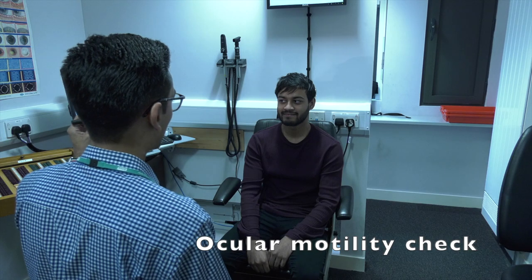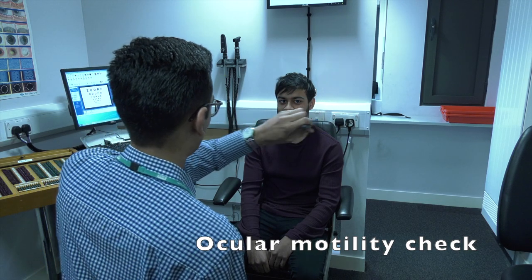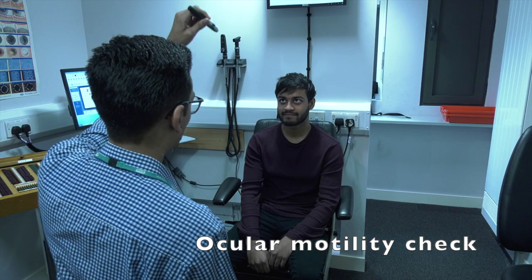For the ocular motility check, you will be asked to follow a small light with your eyes whilst it is moved in different directions.